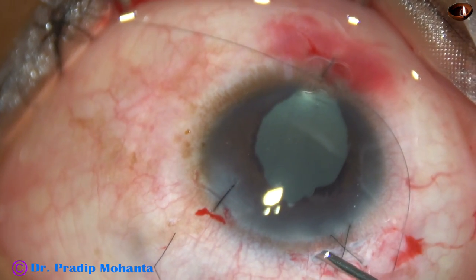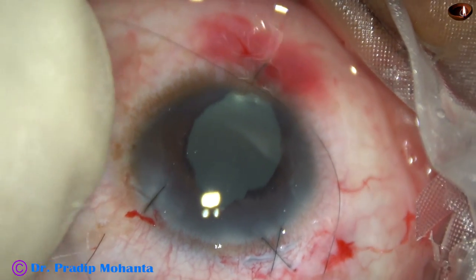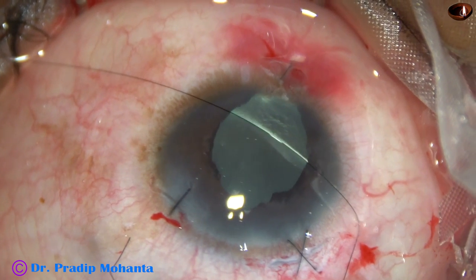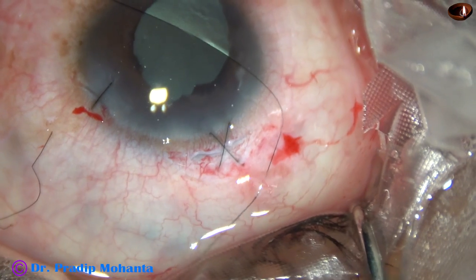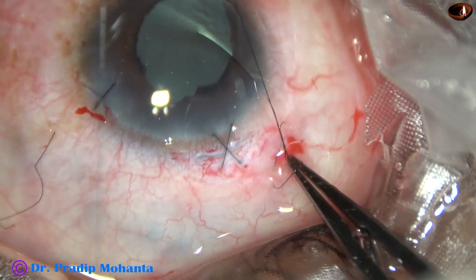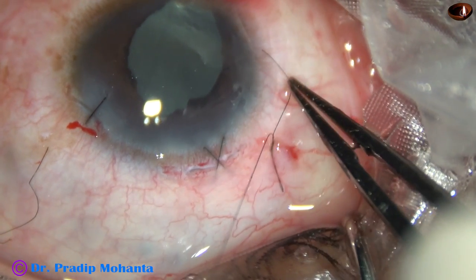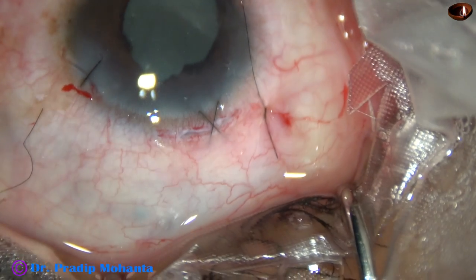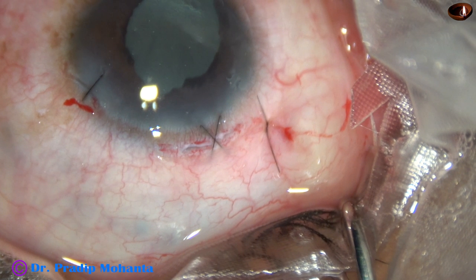With a little moxifloxacin, some fluid goes in and now the intraocular pressure is on the higher side. In this case the last step has been hydrating the main wound with moxifloxacin. Now the conjunctiva is being opposed by the releasable suture — three throws, one, two, and three. Pull the suture, cut the longer thread shorter than the other thread, but keep the other thread longer. The idea is you know which thread to pull: you pull the longer thread and the suture will come off.